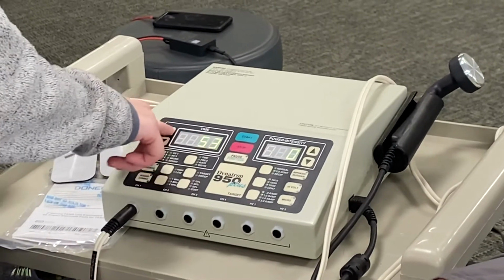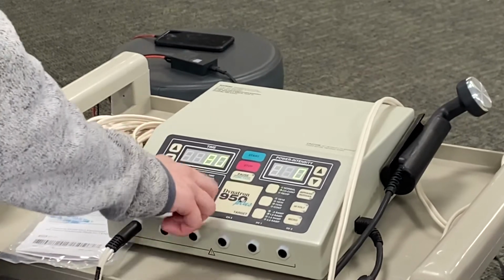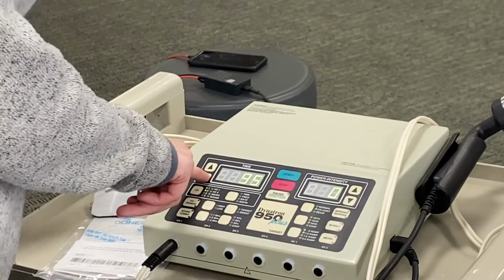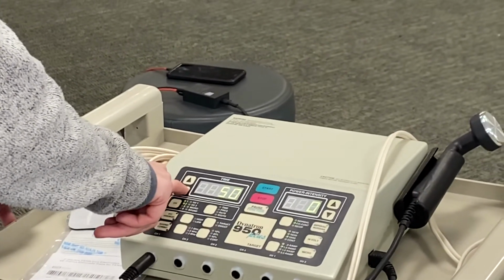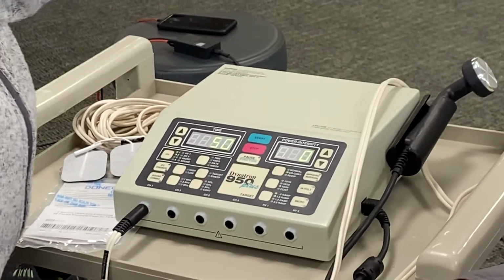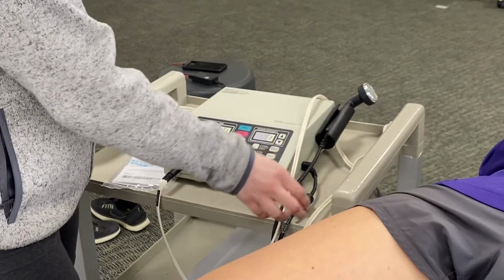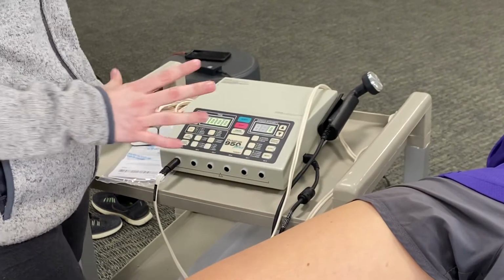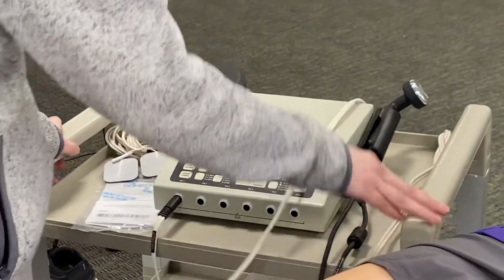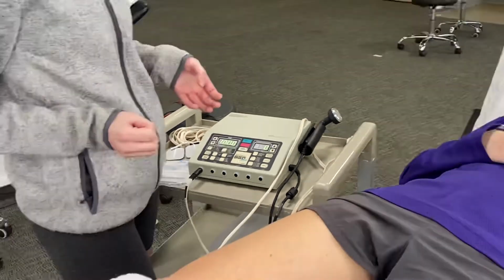The rate, I'm going to have at 80 pulses per second. And the width is going to be 50 microseconds. That is going to allow us to activate those A beta nerves. Since she's a smaller person, I feel like that is going to be adequate to activate those nerves, but if we need more, we can also increase that. I'm going to make sure this is continuous, so the E-stim is on during the whole time. And then the amplitude is just going to be a comfortable, strong tingle for the patient.